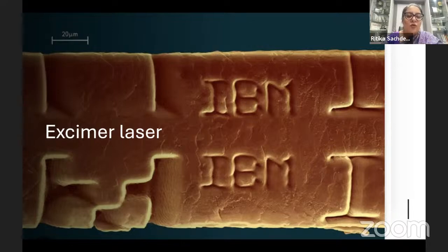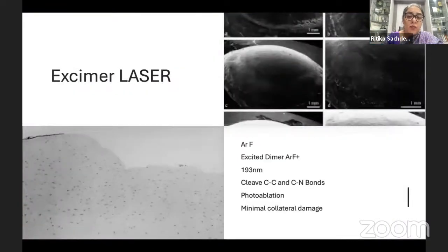So that is how fine the laser was. It, of course, got patented by Srinivasan and got used in the eye by Trokel et al. And so this is what the Excimer laser did. It was a photoablative laser, and it could create very precise cuts or ablations, right?